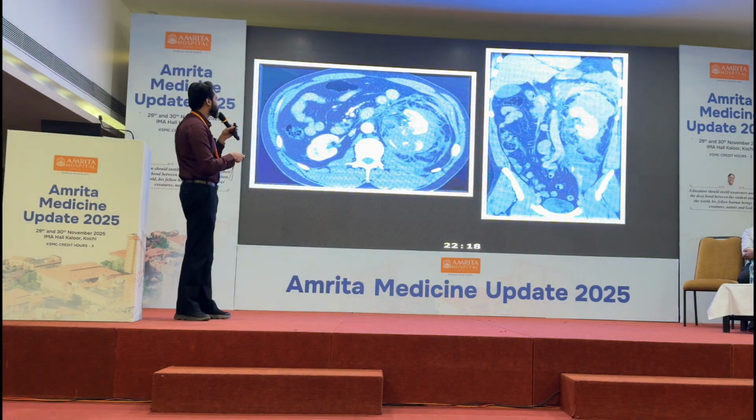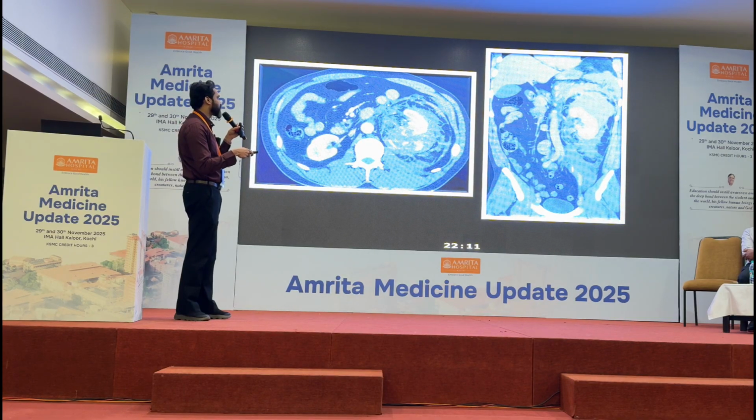And we might end up with something like this. This is a patient who had a massive hematoma around the kidney. That's the kidney, and this is a massive hematoma around the kidney.